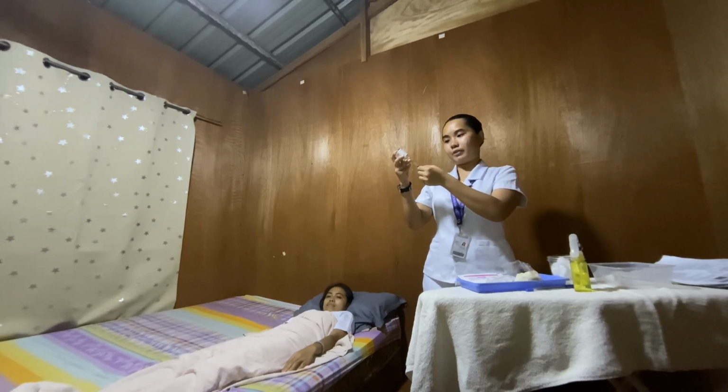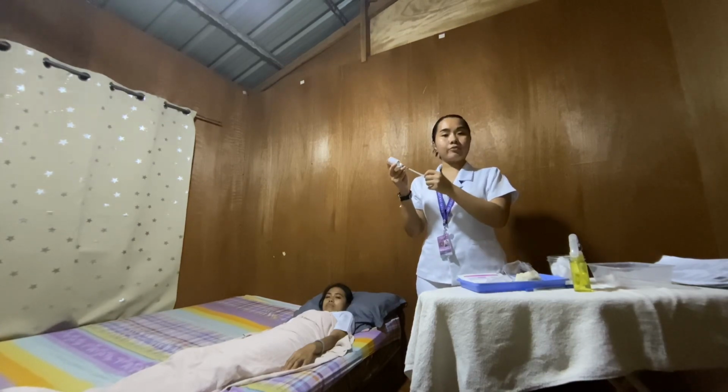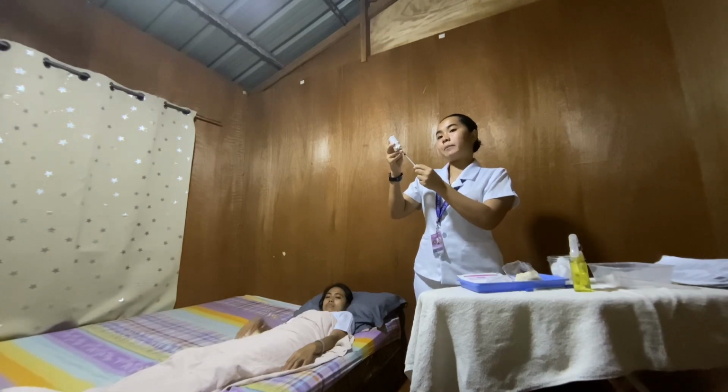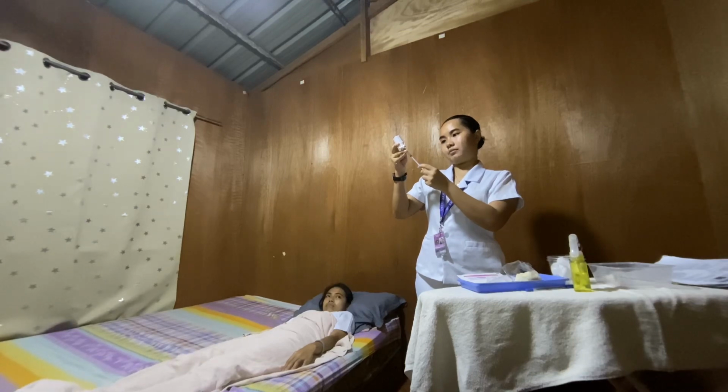What we're going to do next is to withdraw the prescribed amount of medication by holding the vial down, then moving the needle tip so that it is below the fluid level, then withdrawing the medication.